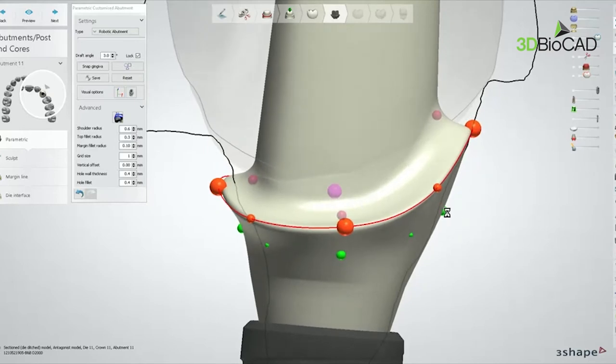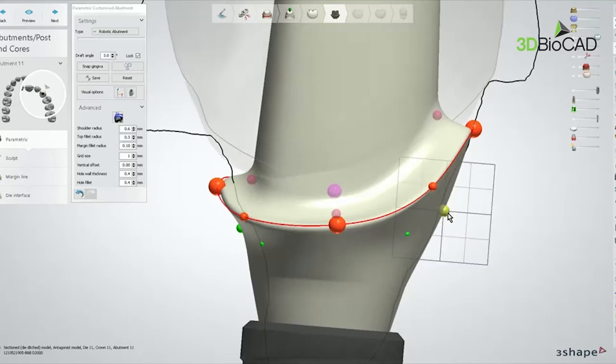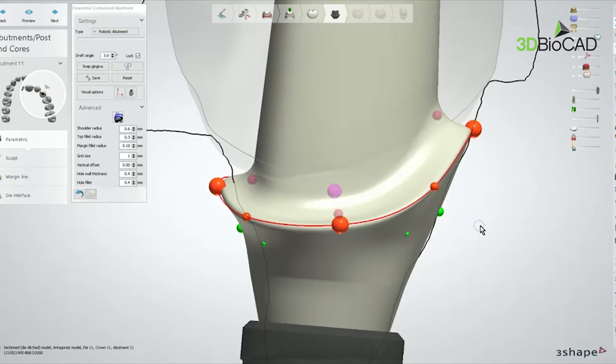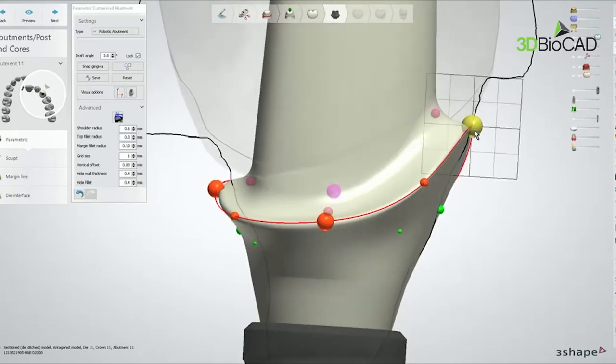We can see the green dot here. We can feel it right away. Maybe I can just grab that green dot and bring it in and out. Yeah, I know that's easy to figure out. But how about this? Just go on top of the orange dot and scroll up and down with your mouse. And also push and hold the shift button on your keyboard, grab all of them, and scroll up and down.